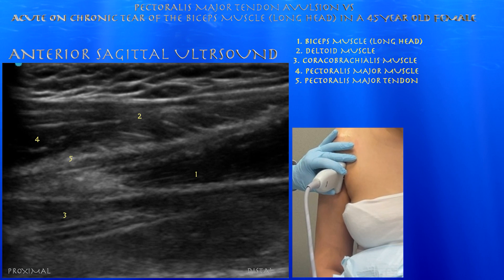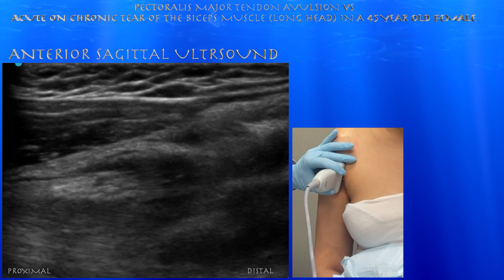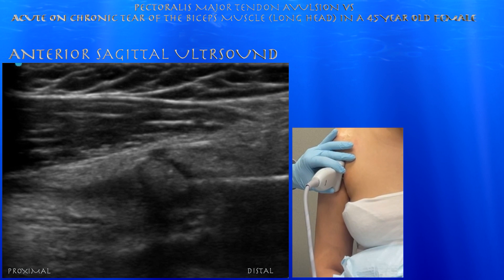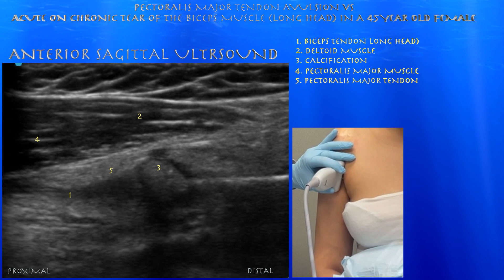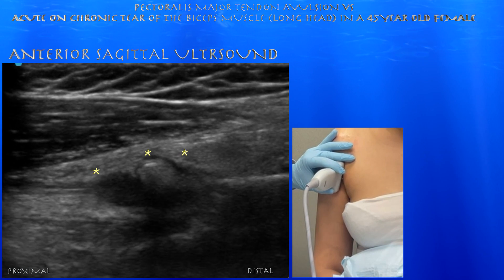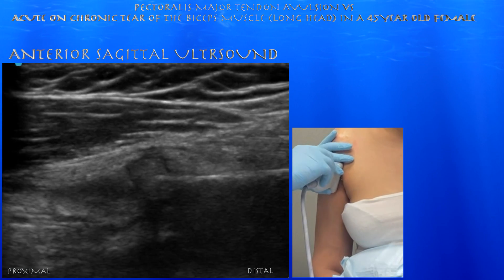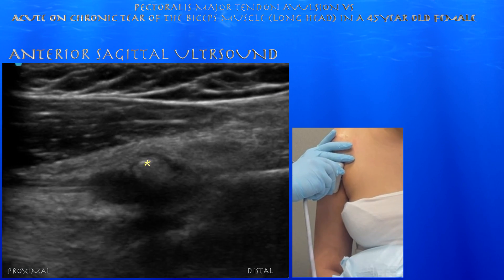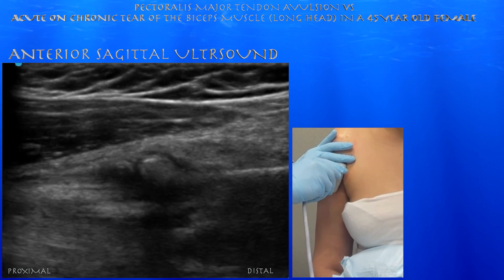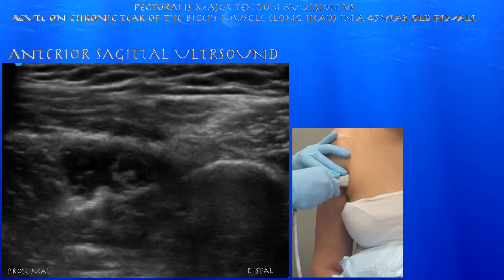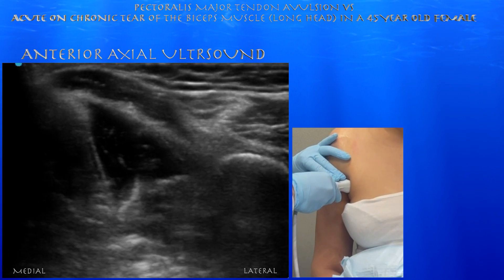Here's the biceps long head muscle in a sagittal plane. You can see the pect major muscle overlying it with the pect major tendon underneath it. Here's this calcium spot — it looks like it could have been an avulsion from the humeral shaft.